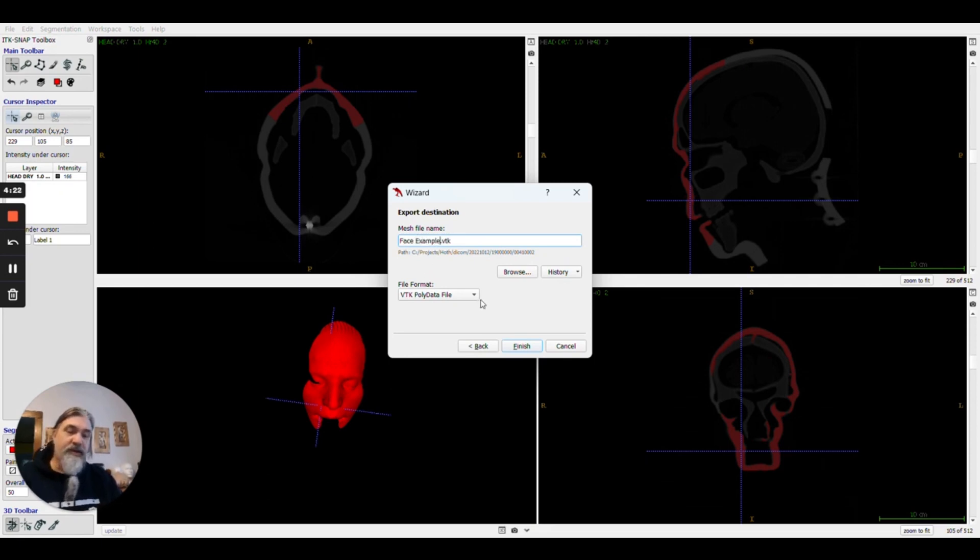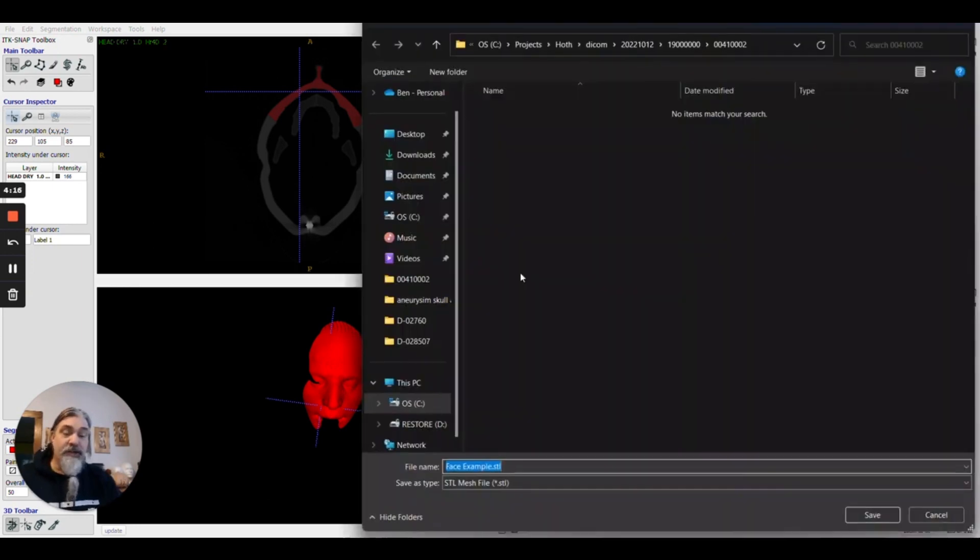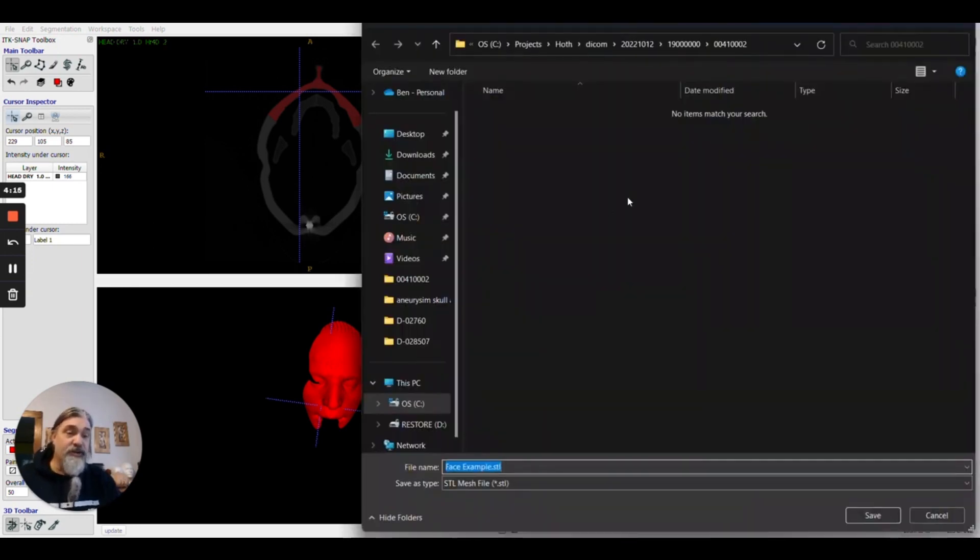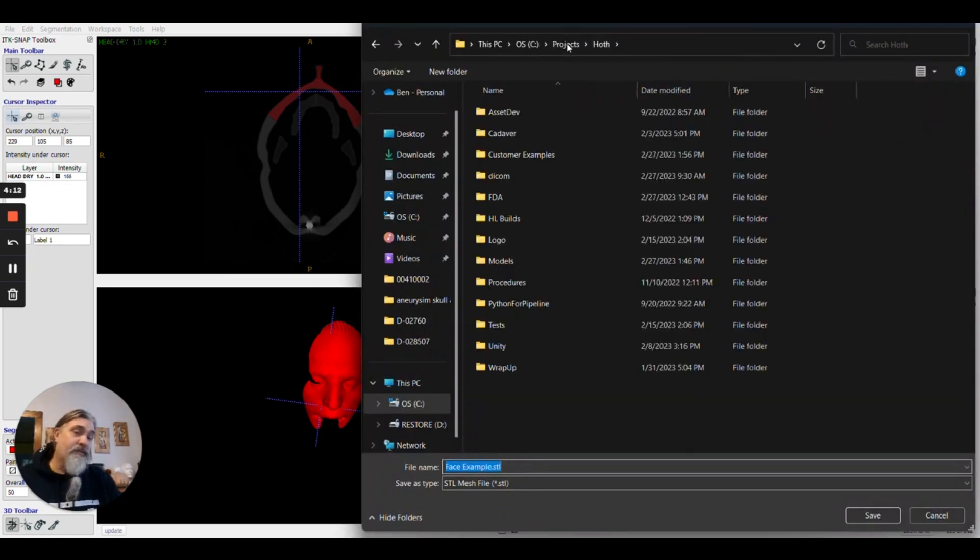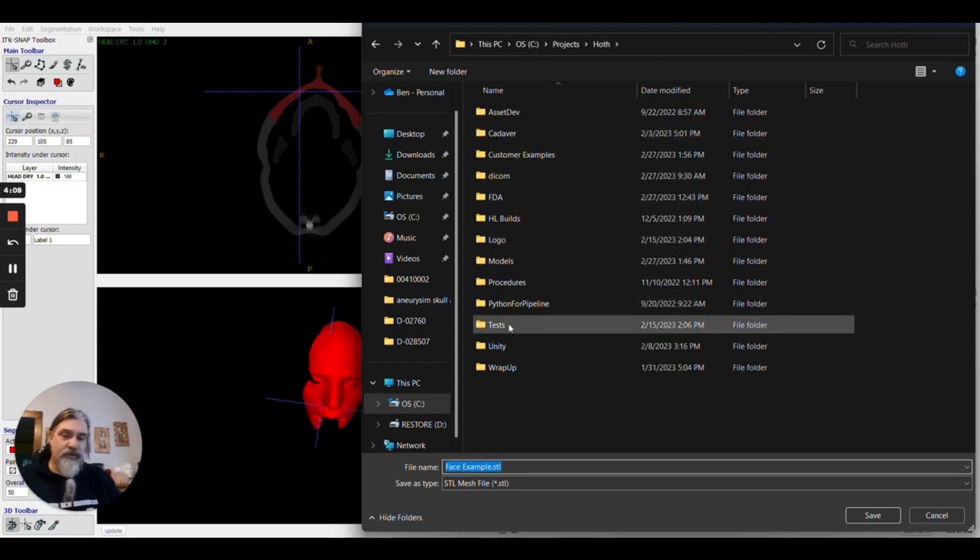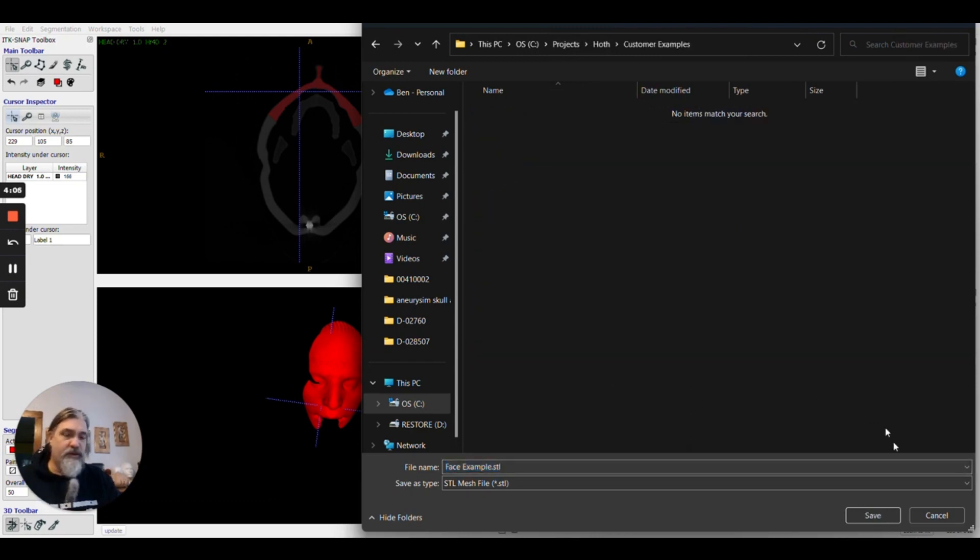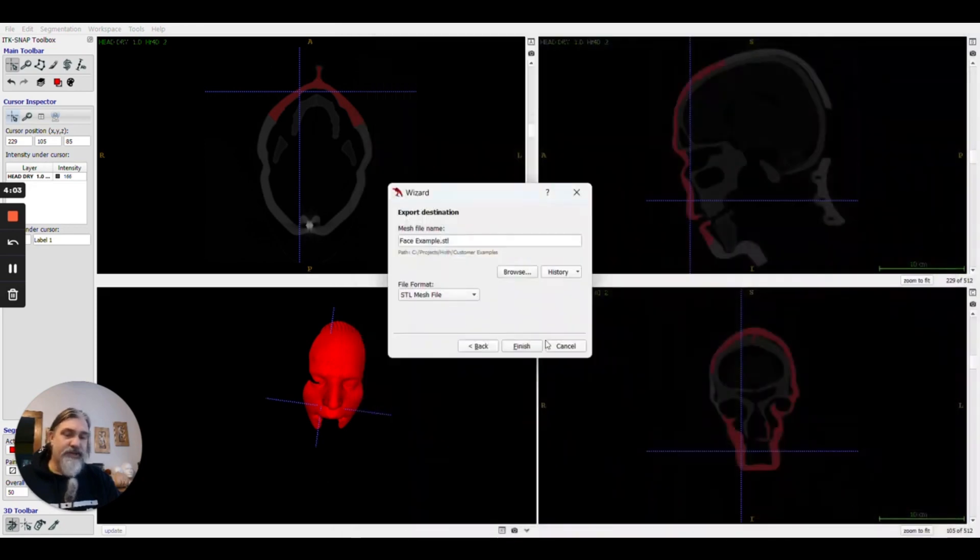For our purposes, we want it to be an STL mesh. Once that's done, you're going to want to browse and find wherever you want it to be. Let's go in here and we'll save it and finish.